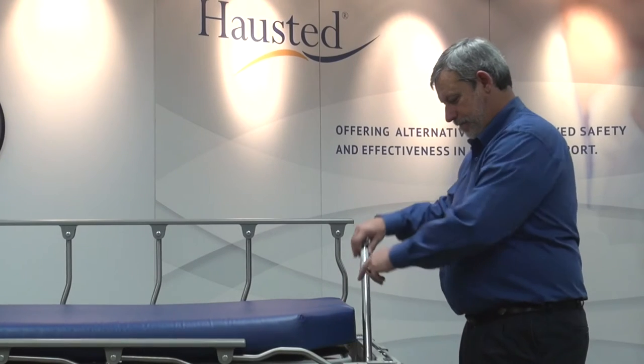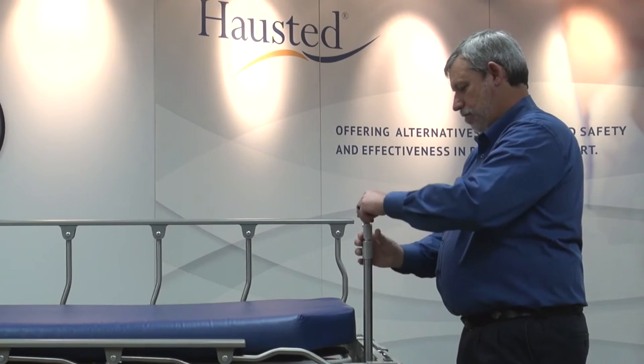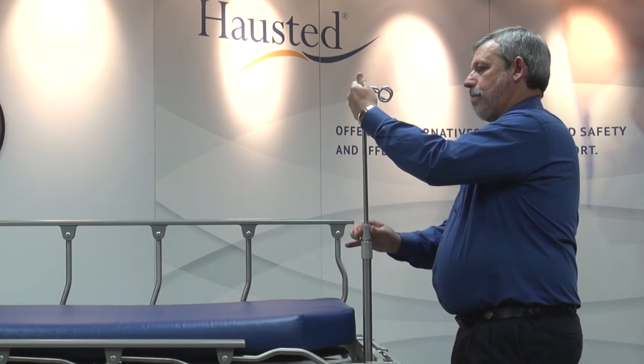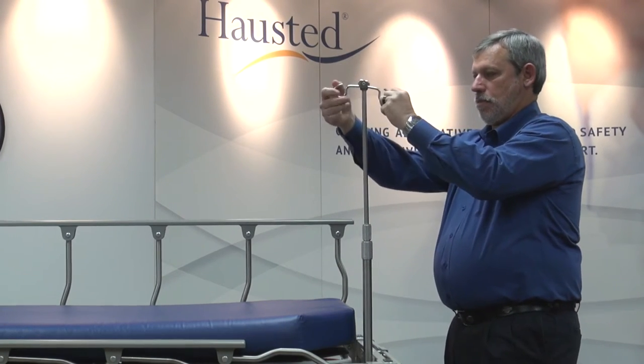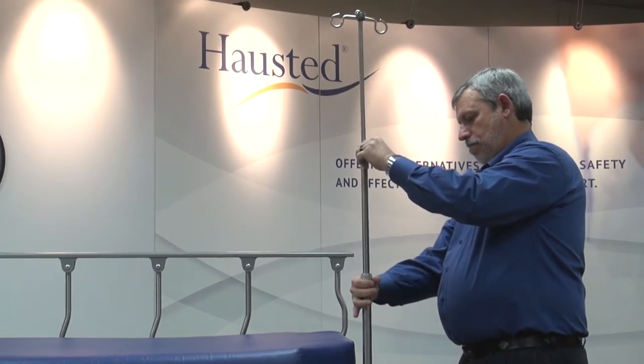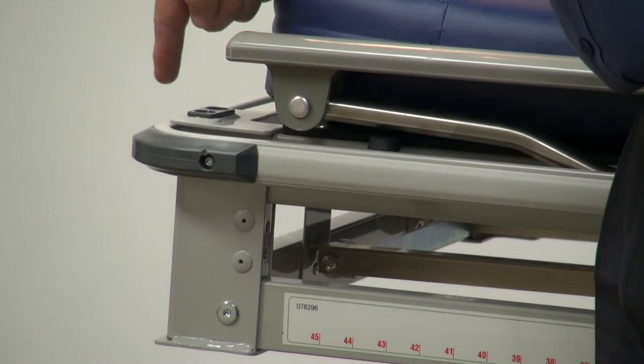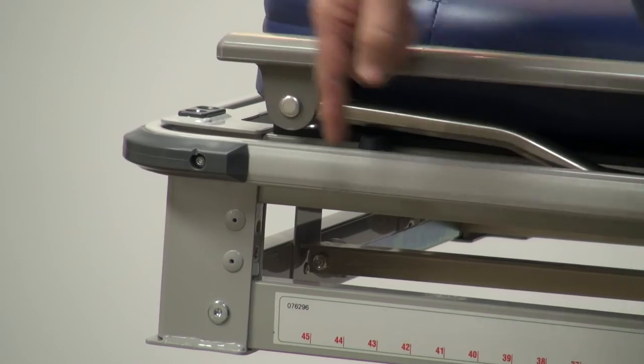The stretcher has dual IV accessory welds on all four corners. An IV pole is permanently mounted at the head end and telescopes from 20 to 45 inches and can fold down when not in use. The stretcher also features a heavy duty, corner mounted, non-marring bumper system.